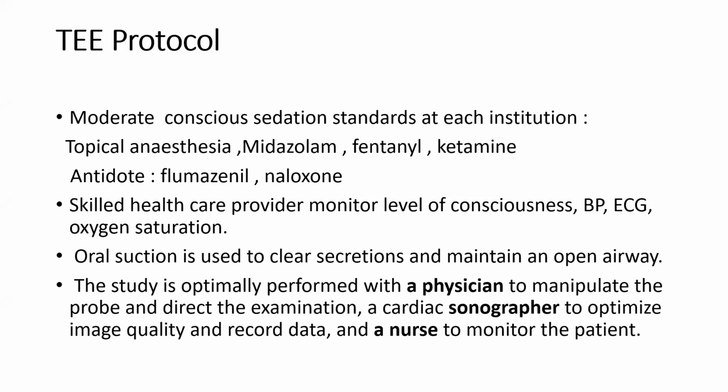You need to monitor, of course, the blood pressure after each dose. When you give 1 milligram, you check the blood pressure and see the response. If the blood pressure is maintained, you go higher until the patient becomes moderately sedated. Then you gently introduce your probe. As I told you, 80% of the time when you put the probe in and ask the patient to swallow, it will go to the esophagus. Definitely, it will go to the esophagus.